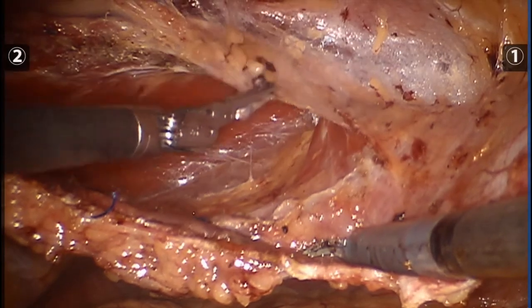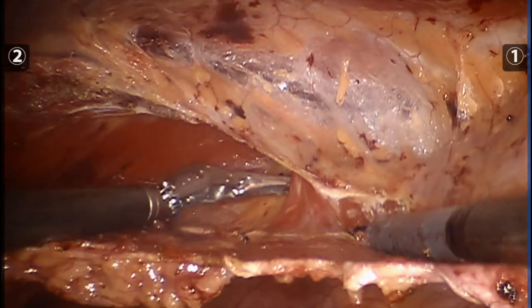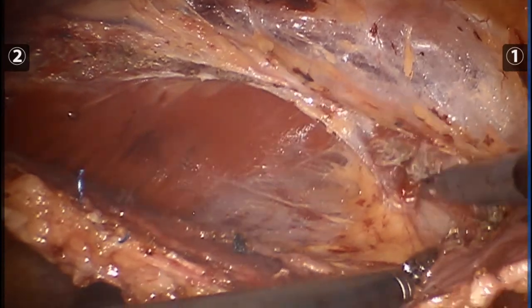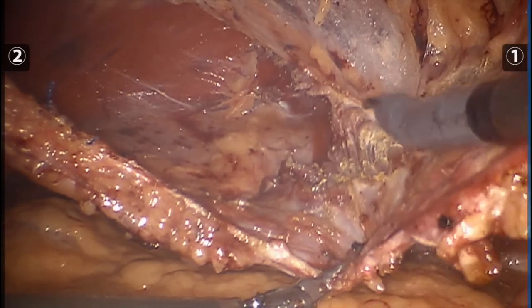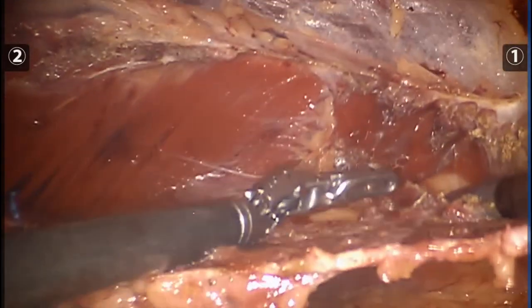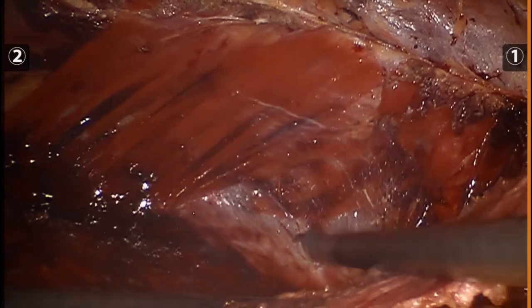As we progress caudally, you can see the posterior leaf of the internal oblique aponeurosis, as well as diminution of the transversus abdominis muscle. It is important to divide the transversus abdominis in a downward fashion atop the posterior sheath, as opposed to laterally, where you can get into an interparietal plane. With lateral and eventual posterior mobilization, this will result in a massive release of the posterior sheath.